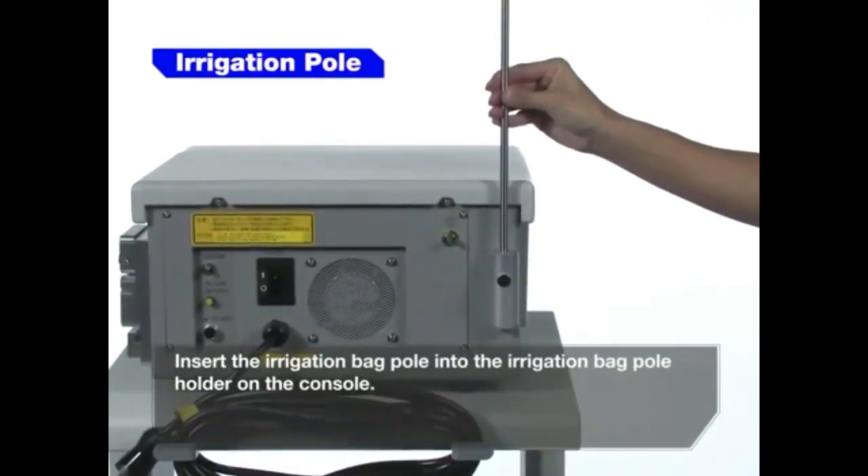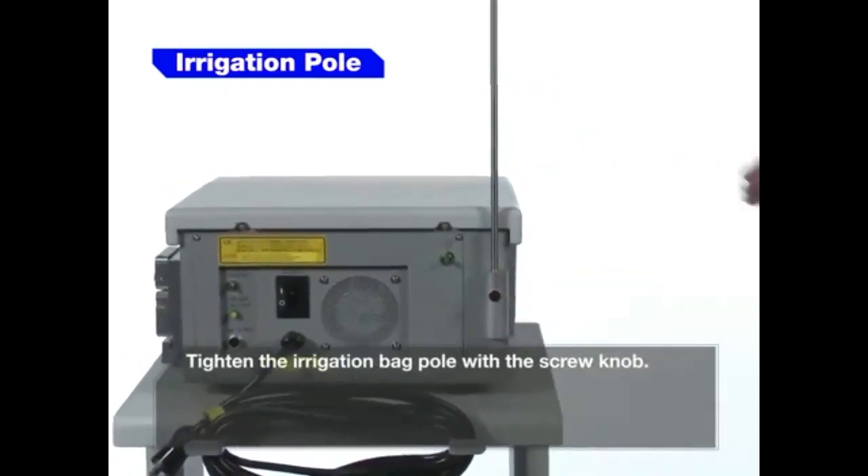Insert the irrigation bag pole into the irrigation bag pole holder on the console. Tighten the knob to secure the pole.